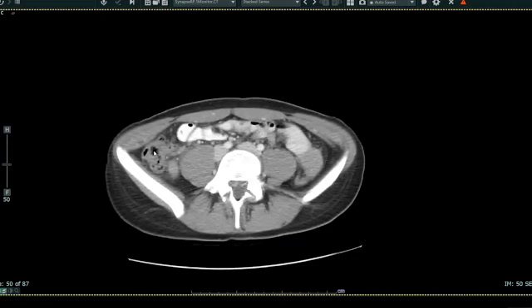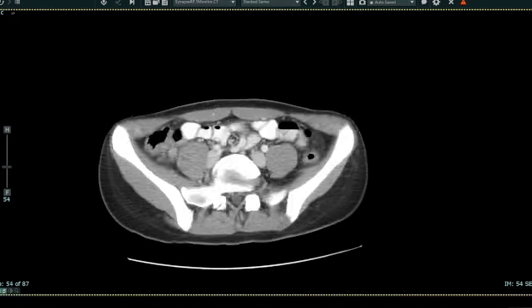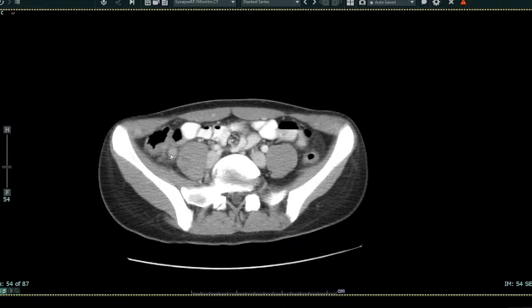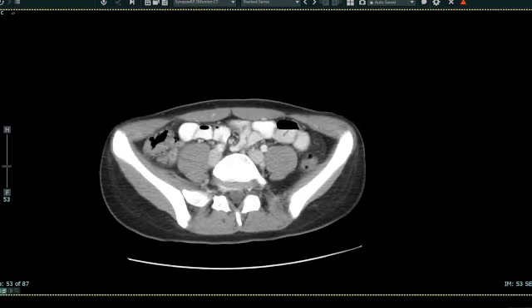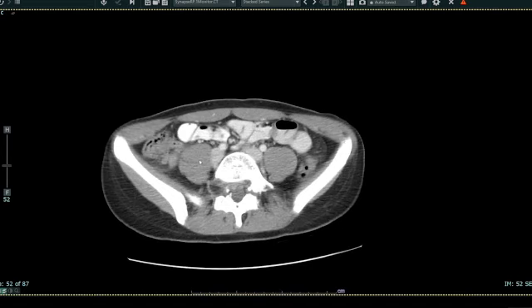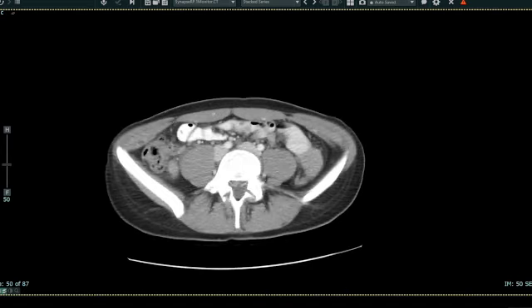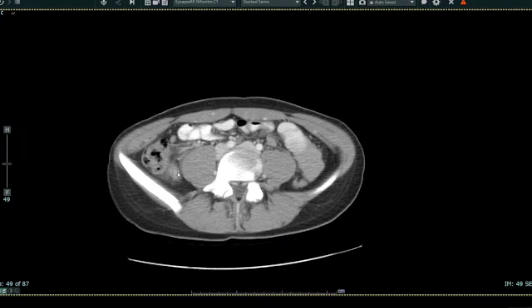These areas here, which have a mixture of darker and gray color, are large bowel loops. As we get more inferior, we see a structure here which is the appendix. This is a structure which should be air-filled and should be smaller than we're seeing here. We also see some inflammatory changes surrounding the appendix and some reactive lymph nodes.